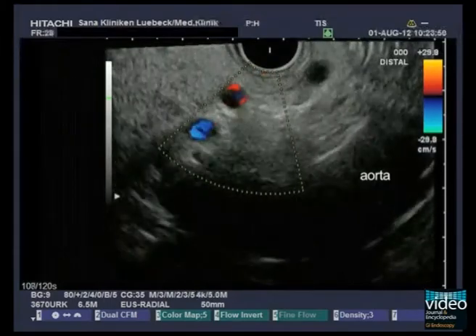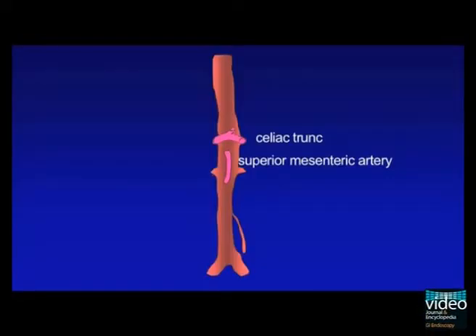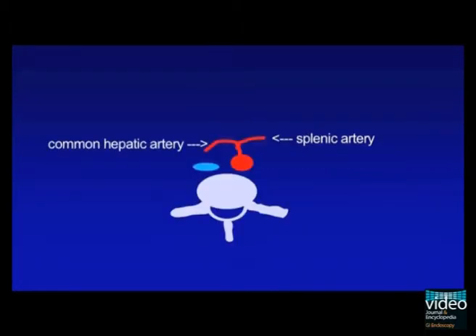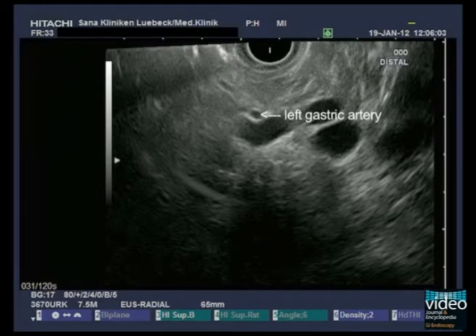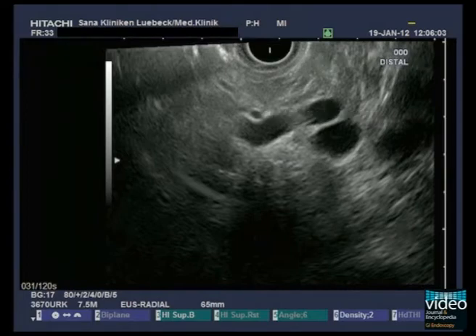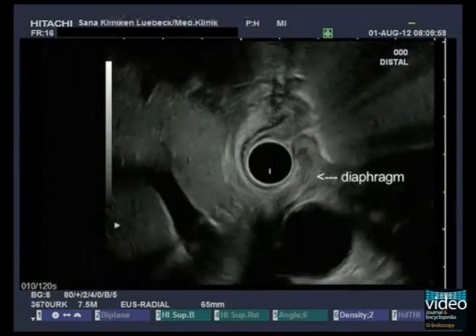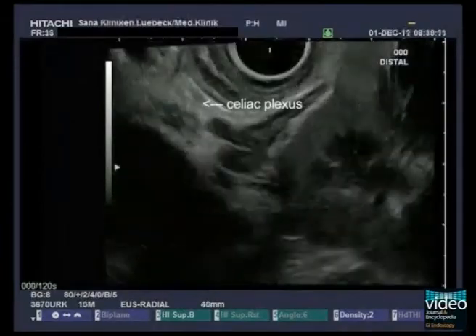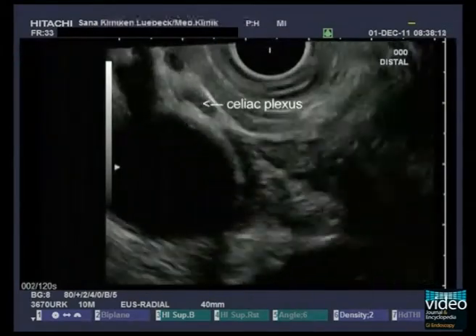Following the descending aorta, you will find step by step the main arterial vessels. First, the celiac trunk with the common hepatic artery and splenic artery is visible. These vessels imitate the image of a flying bird. The left gastric artery is only demonstrable if the instrument is carefully withdrawn until a cross-section of this small artery appears. Proximal to the celiac trunk, in front of the aorta, the echo-poor diaphragm is located. Close to it, the pearl-like celiac plexus can be seen and should not be mistaken for lymph nodes.